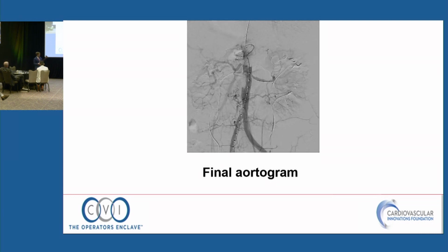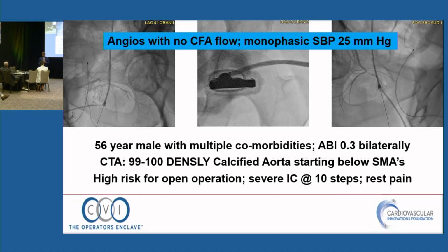Let me just stop. One more case. All right, one more real quick. This is a pretty dang cool case done 3 weeks ago. This guy literally could not walk 10 steps. He's only 56, but this is an old 56. The same surgeon from Texas, we got a bunch, but just happened he sent him to me. He was sent for endarterectomy, no way.